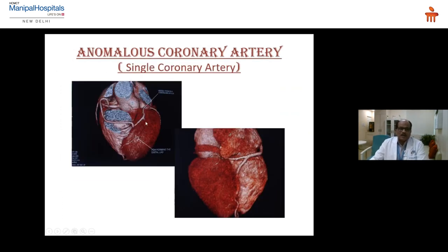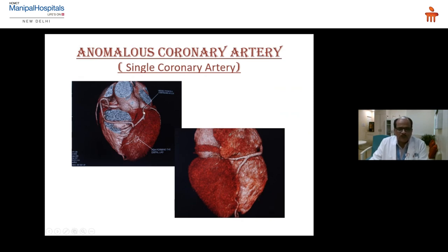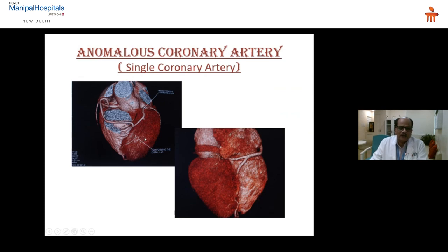This is a case of a single coronary artery arising only from the right side — coming in front of the RVOT, going and passing to the left side along the interventricular septum. This is the LCX, and posteriorly the PDA goes behind the apex and comes up along the interventricular septum to form the distal LAD and diagonal branches. This is a single coronary artery.